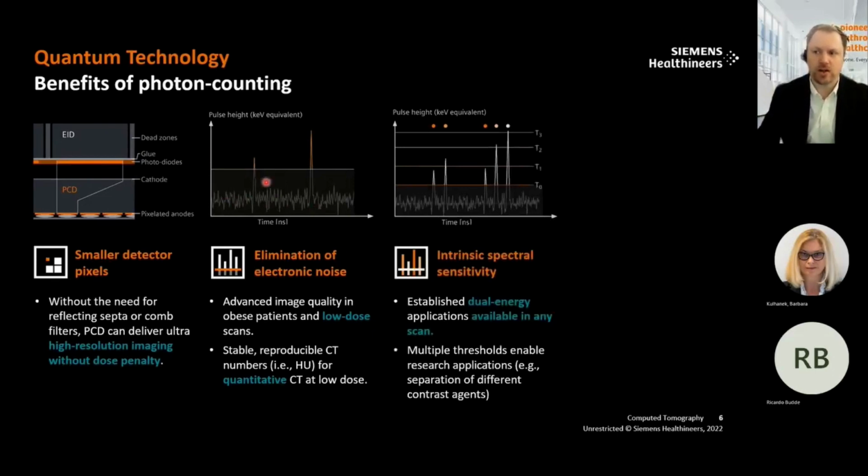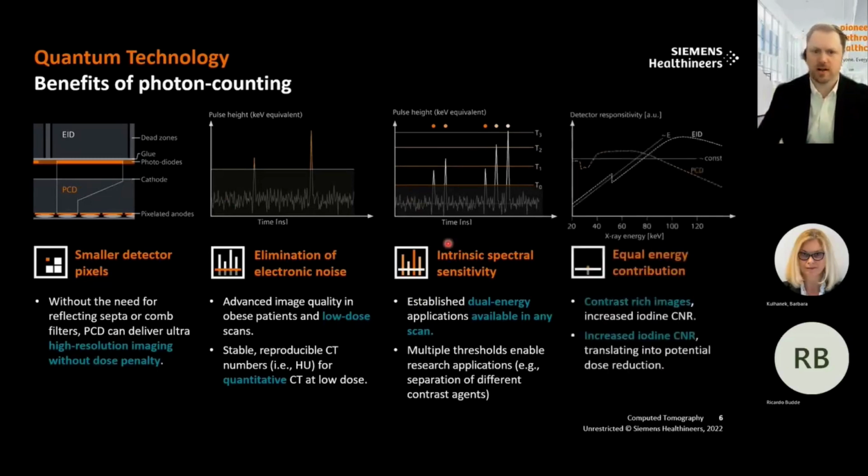One threshold eliminated the noise, but this system allows us to apply up to 4 energy thresholds, allowing us to do multi-energy imaging. Today, that means the types of dual energy acquisitions that we would have thought of before, but also opening the door in the future for things like multiple contrast agents as those get cleared by the FDA for further use. So really a wide open door of possibilities with the spectral information always available on the detector.